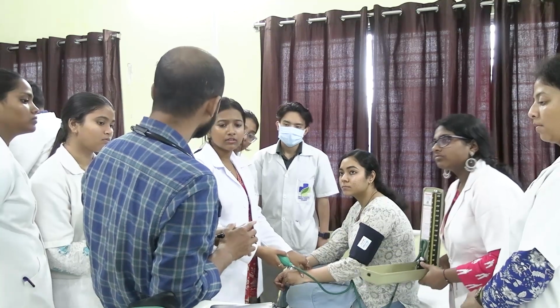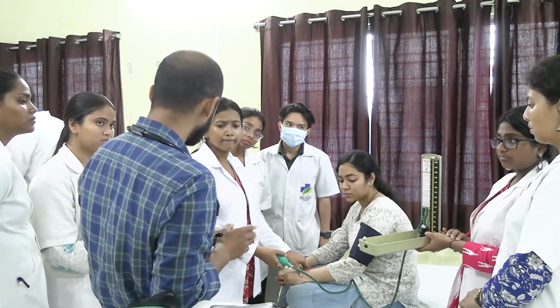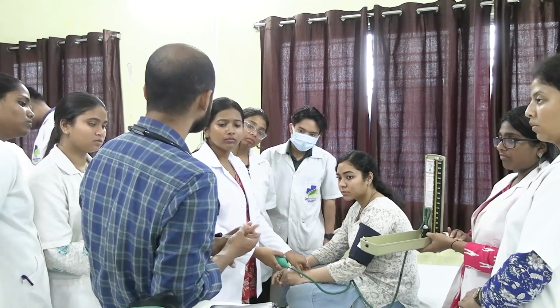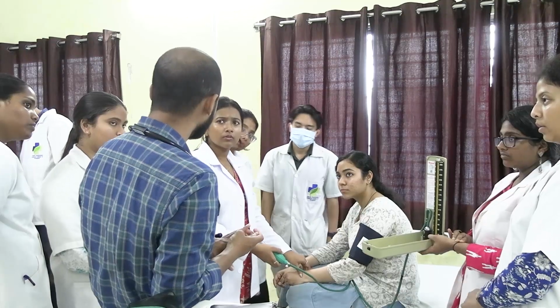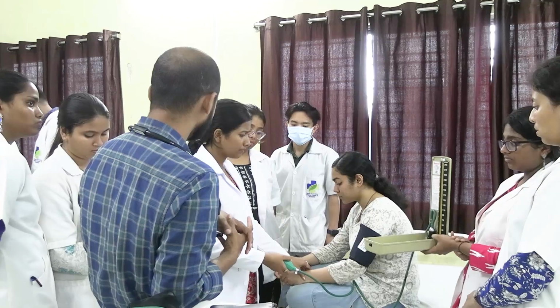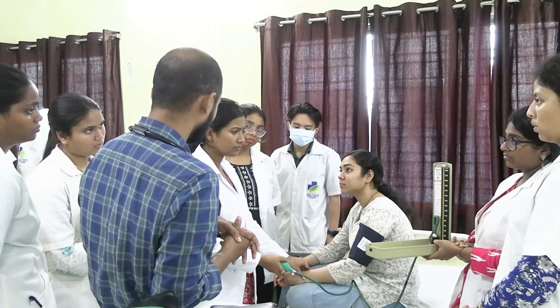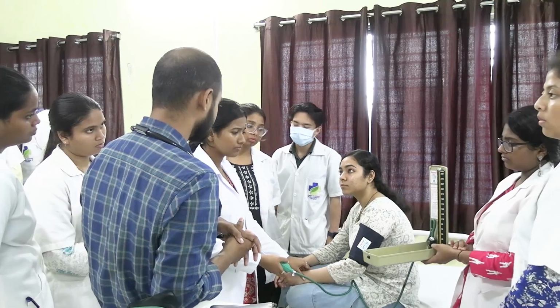What is the use of this one? To block the impulse. This is to feel the pulse, and this is to block the backflow of blood. So did you find it? Yes. Okay, it is pulsating. Now raise the pressure.